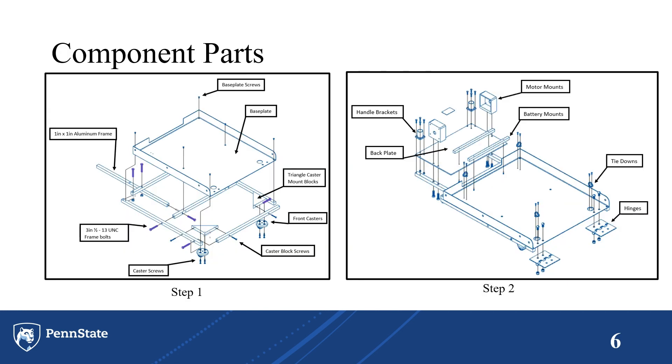These are the component parts. Step one features the frame, casters, and the base plate being attached. Step two covers the sub-components featuring the hinges, tie-downs, and all the battery mounts and motor mounts.